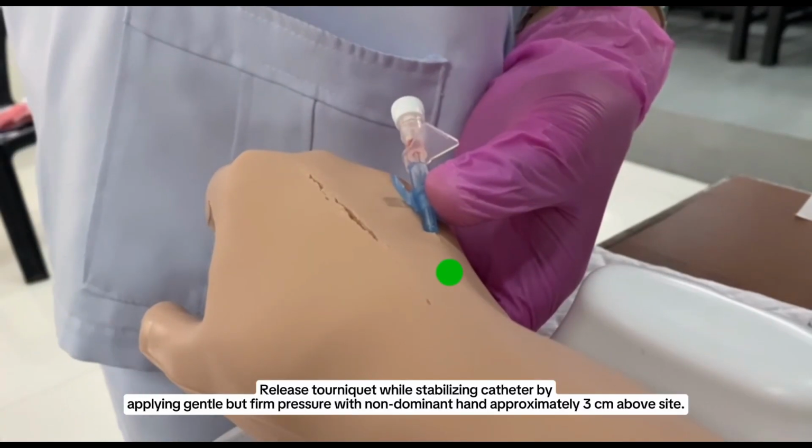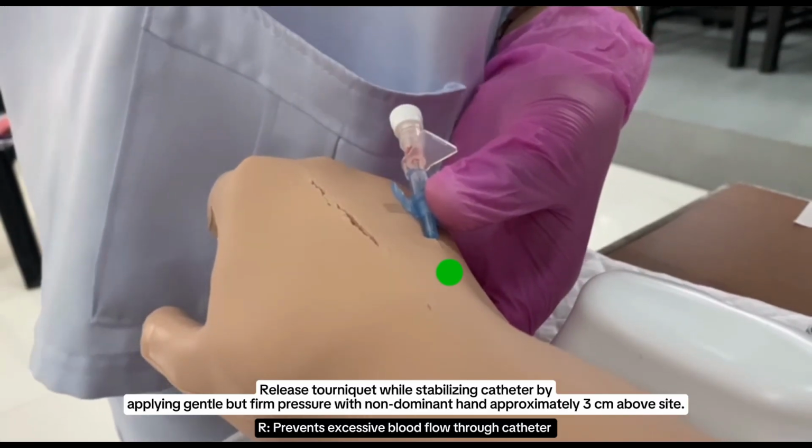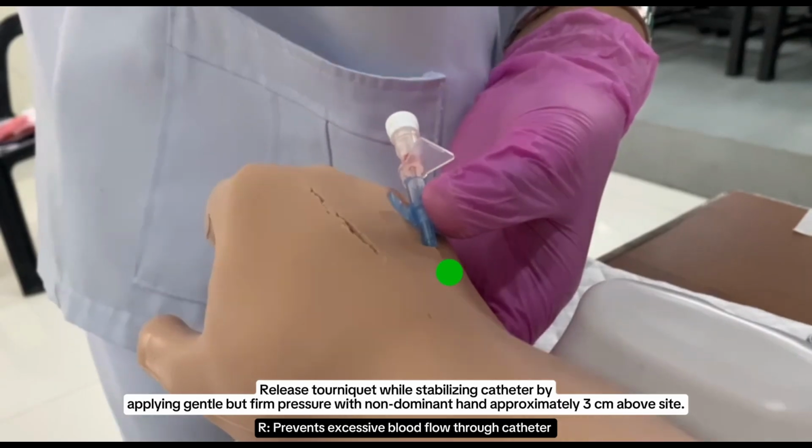Release the tourniquet while stabilizing the catheter by applying gentle but firm pressure with a non-dominant hand, approximately 3 centimeters above the site. It prevents excessive blood flow through the catheter.